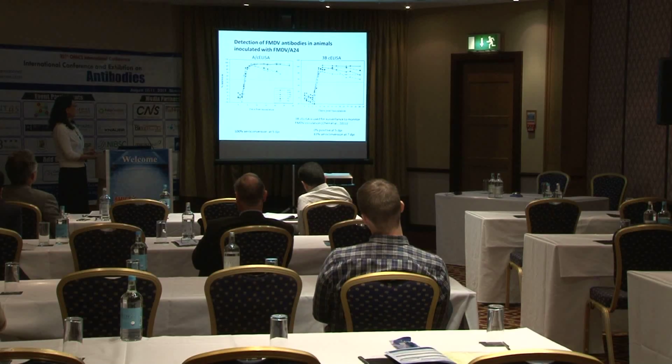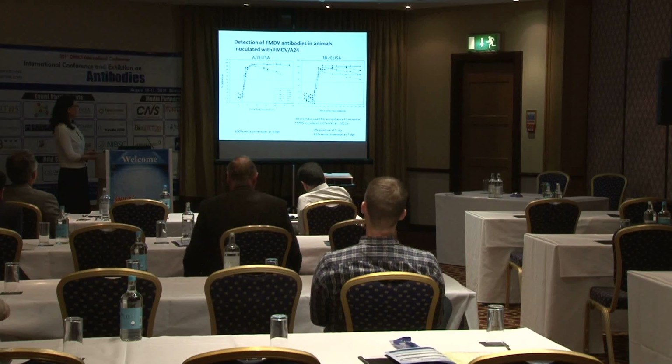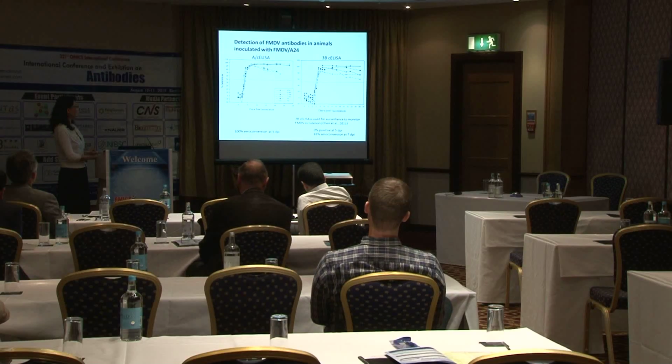As we can see, from day 1 to 4 dpi, all the samples are again negative, and then this one shows positive seroconversion later compared to the newly developed serotype A C-ELISA. 80% positive seroconversion occurred at 7 dpi.